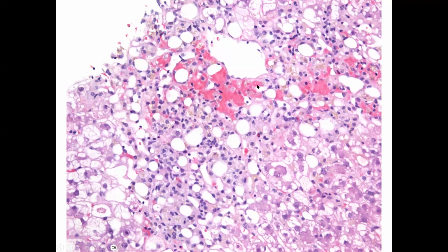And so when we look at it in higher power, here's our central vein, and there's hemorrhage around the central vein. There's an absence of hepatocytes around the central vein, and there's a lot of inflammatory cells in here. These cells have abundant cytoplasm, and they're containing some bile pigment and some other pigment. So these are macrophages that have come in and cleaned up.